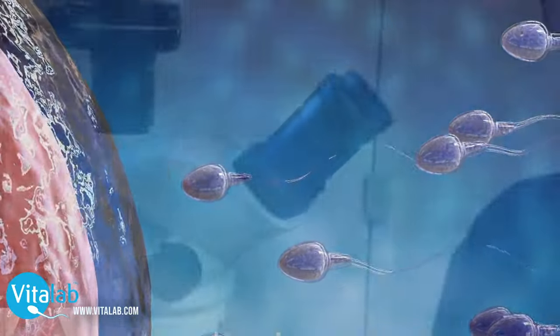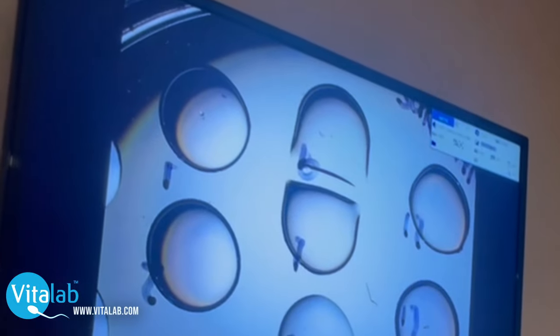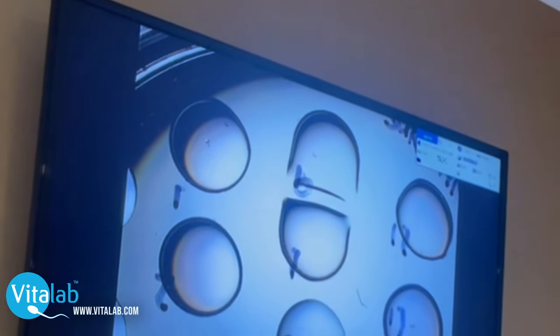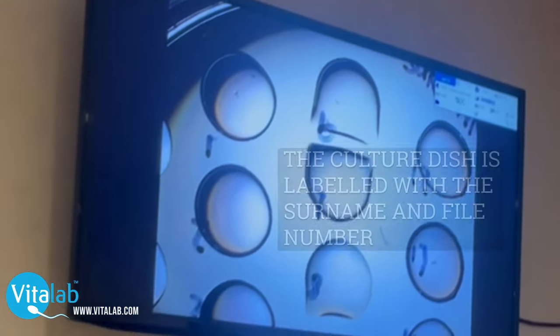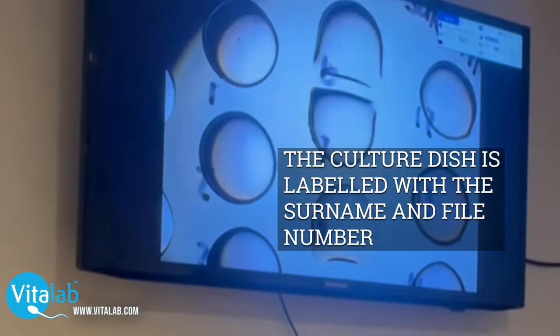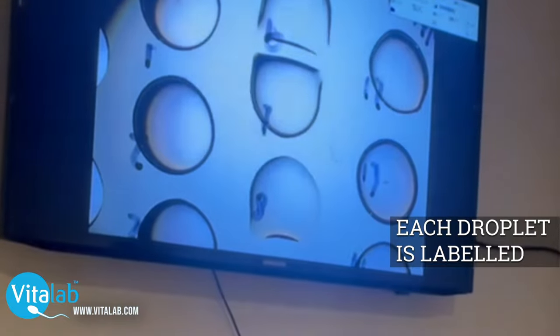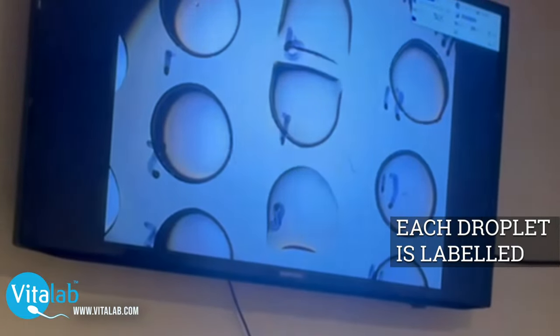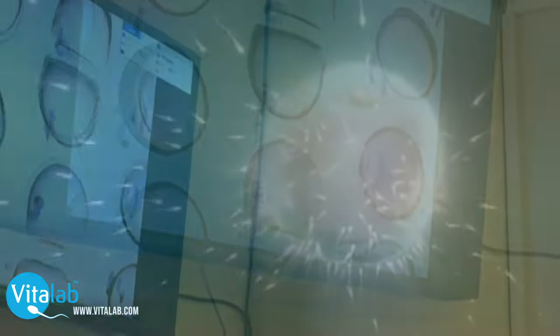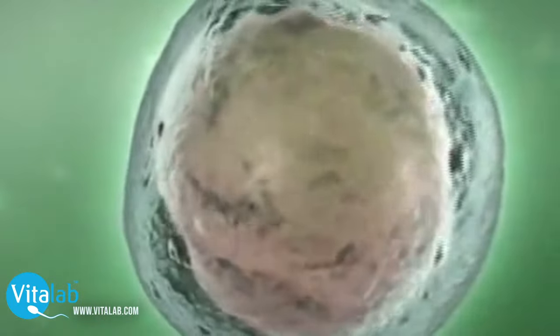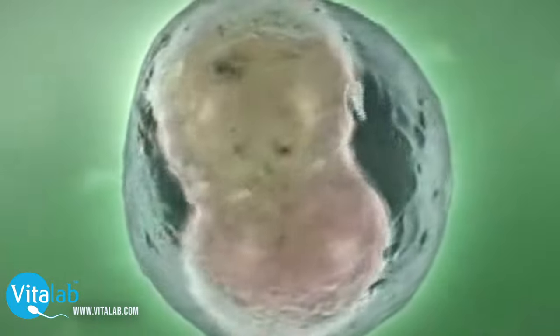After fertilization has been confirmed, the eggs will be removed from the insemination dish and placed into a culture dish. This dish is also labeled with your surname and your file number, and each droplet is labeled individually — one egg will be placed in each droplet. This creates a tracking system so that we know how each egg is developing individually.